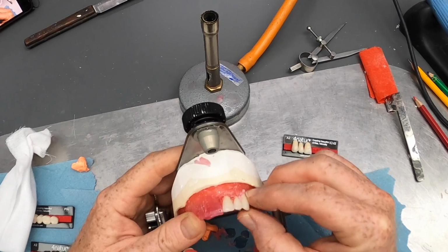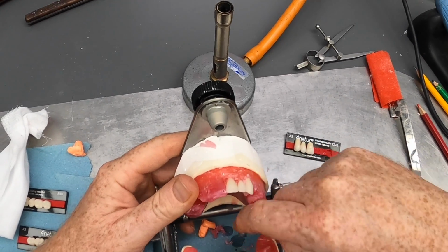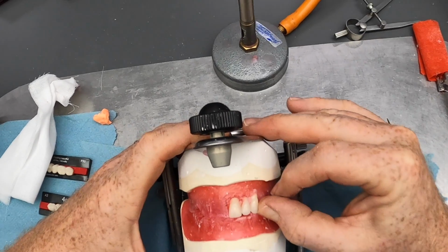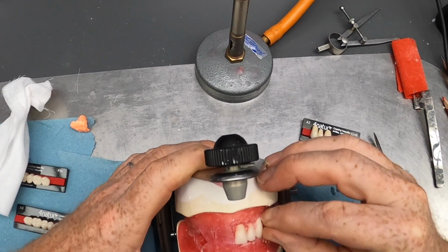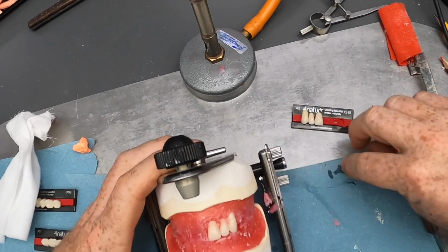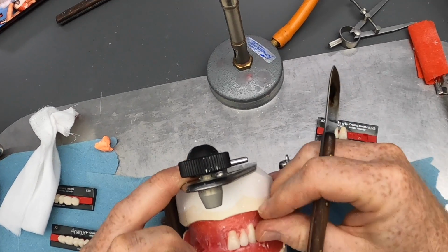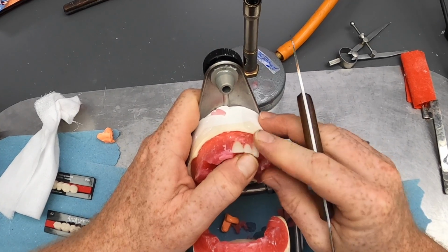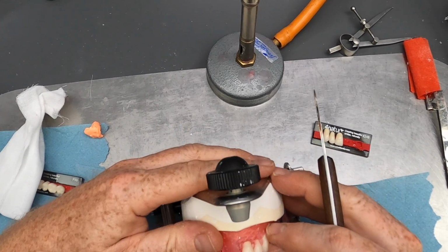So putting it up to the lateral, drop some wax on there, down to the occlusal plane again, like so. Very prominent here in the cervical region, and keeping the tip flush with the block. Okay, and it wants to be vertical. The long axis of the tooth wants to be vertical when you look from the front and from the side, and you almost want to be able to see the mesial aspect of the canine as well, like so, something like that.